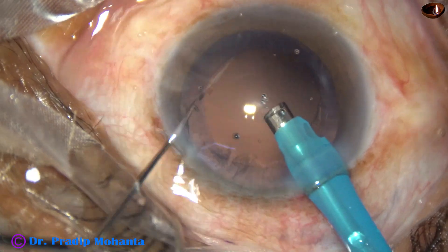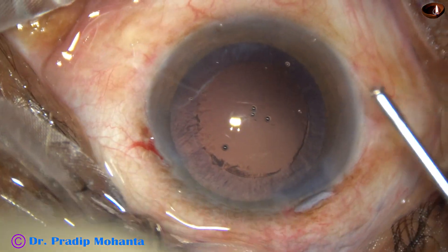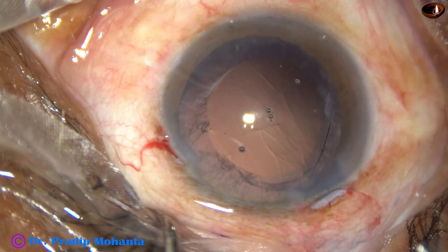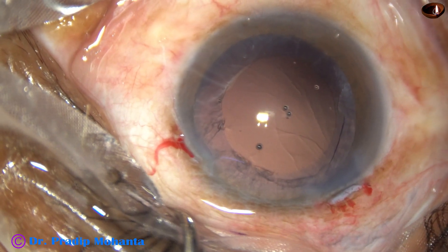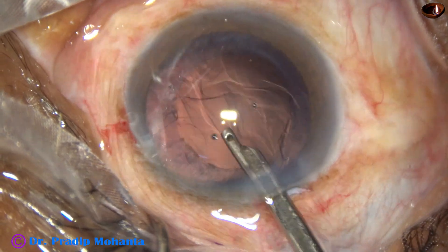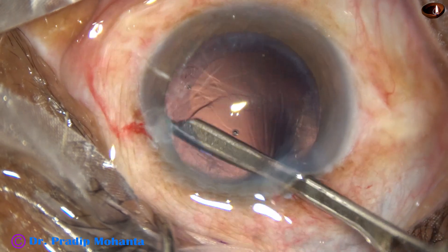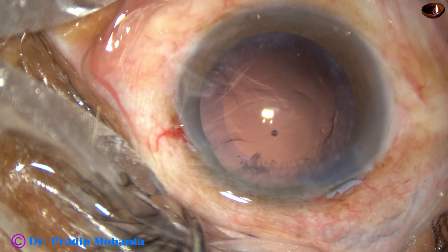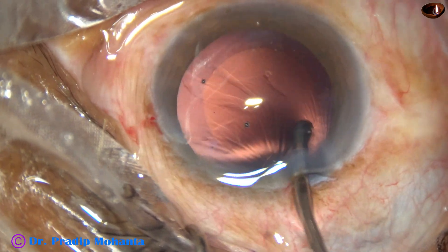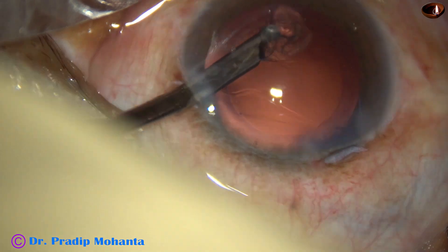The nucleus has been managed and now cortical cleanup is to be done. Some amount of viscoelastic is injected into the anterior chamber to help in maintaining the anterior chamber depth. I use a 23-gauge Simcoe for cortical cleanup — this is surgeon's choice. You can use a coaxial IA or bi-manual irrigation-aspiration. I use Simcoe because it is faster; it is ready with a different drip set and different bottle. Most of the cortex has been removed and this is removal of the sub-incisional cortex.